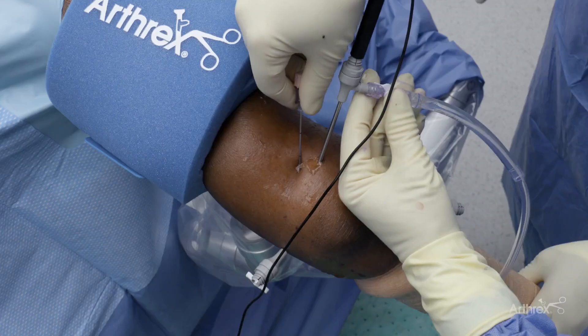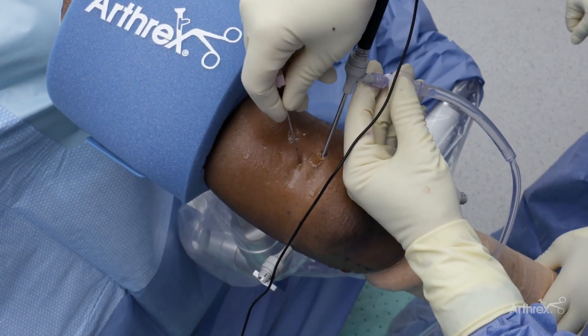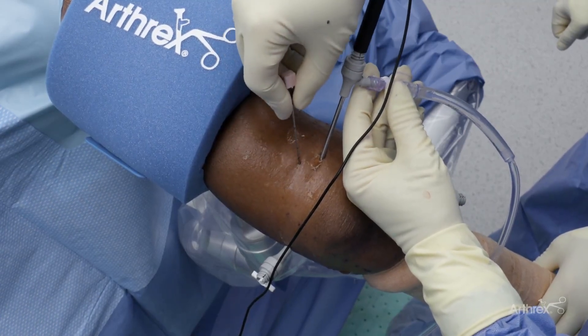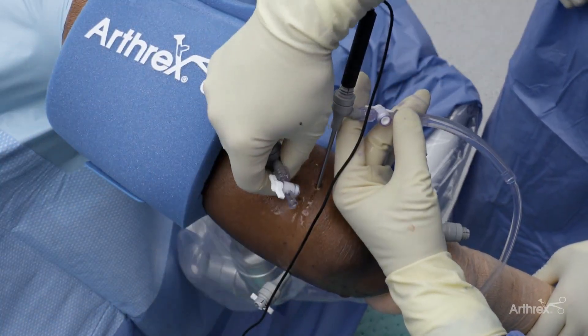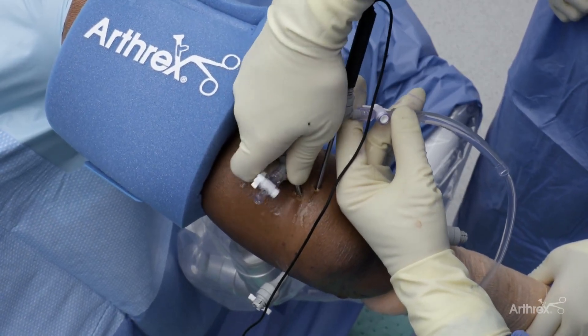If you wish to find a loose body or clean up, you can actually make an accessory portal back in the trans-tendinous area. That's not an issue — you're not going to cause any damage. It's a very common portal to utilize. You get an excellent view down this gutter. As we come back, you can see the olecranon tip and the olecranon fossa. A lot of times you'll find loose bodies back there, and you can make an accessory portal to get rid of anything in that area. You can put this pretty much anywhere you want depending on where your pathology is.